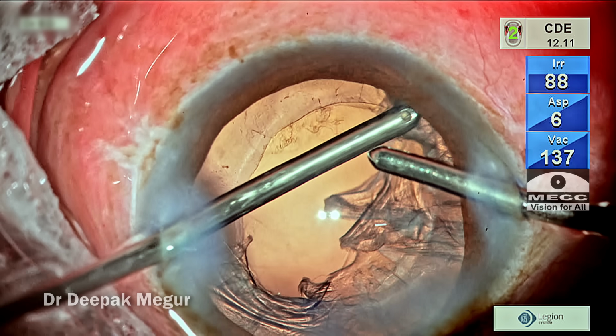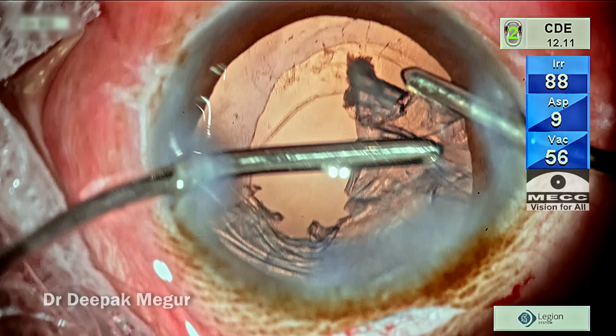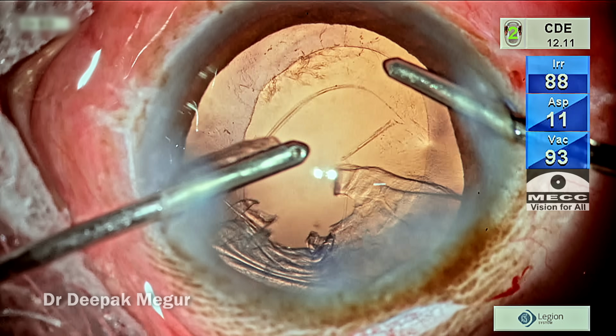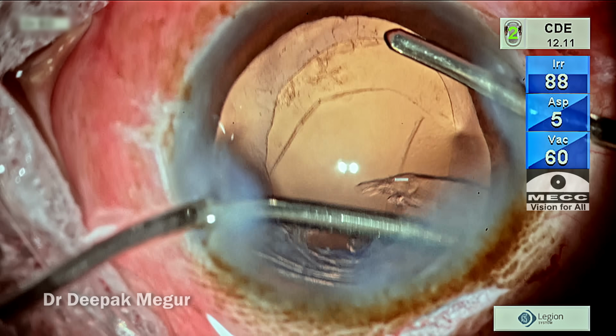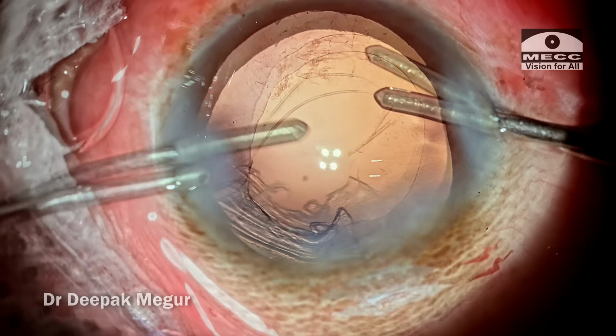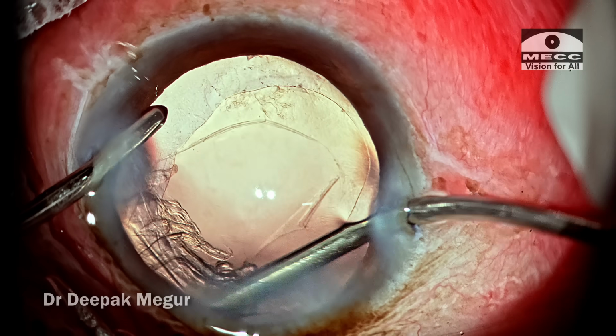Again, in this area, the cortex can be aspirated very well, very easily, and once the cortex is cleared off in that region, the lateral limit of the posterior capsular tear can now be visualized. At this point, I'm thinking maybe I have an opportunity to do a posterior capsular rhexis now. Time to remove the last bit of cortex in the subincisional area.